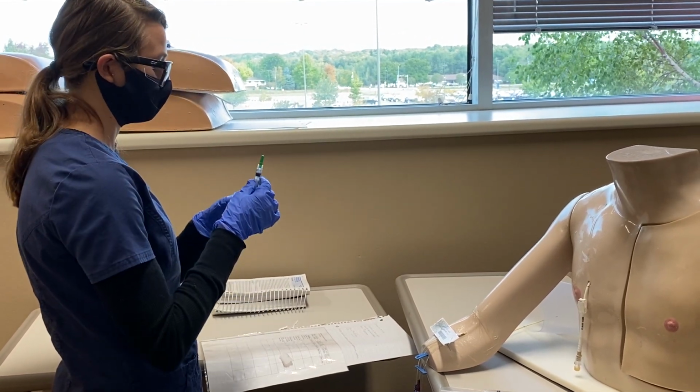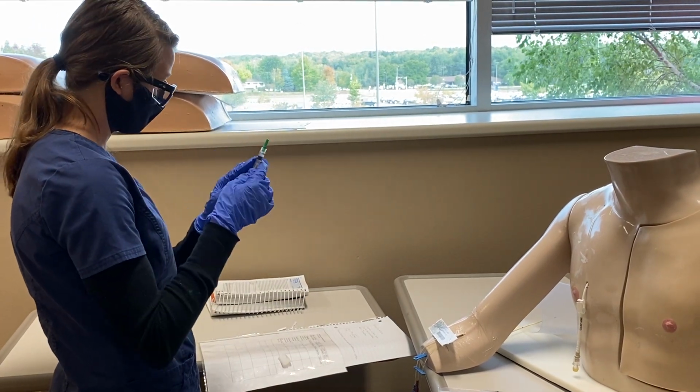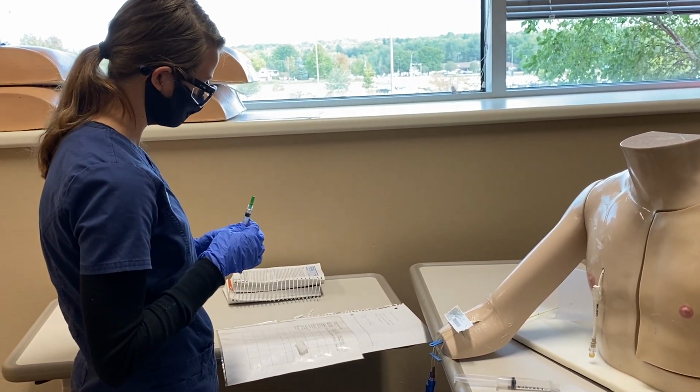Ordered is 1 milligram IV push. After doing my math calculation, I should have 0.5 milliliters. I have 0.5. I'm giving it IV push every 3 hours for pain. He's yet to receive it today, so the time is now.